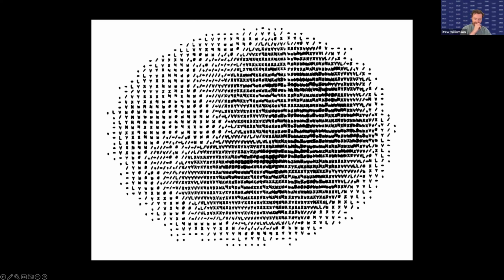And I love that in 1966, the way they represented these 32 levels of grayscale is with the different characters that their typewriter put out. So pretty incredible. But what they did was hook a microscope that captured this sort of image up to a computer that would then compute some histologic features for them.